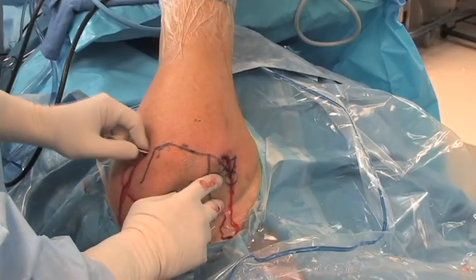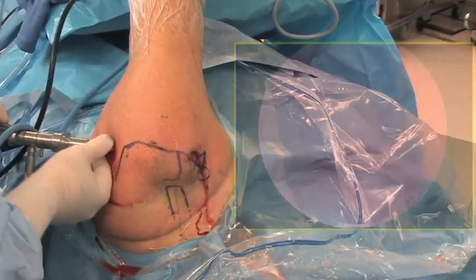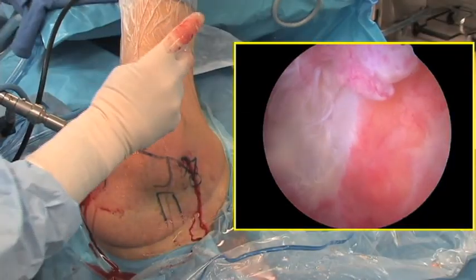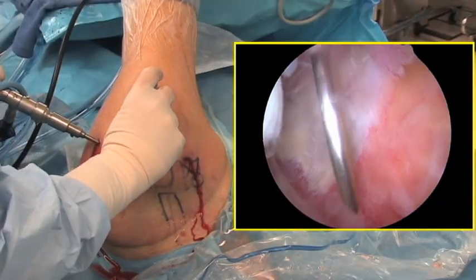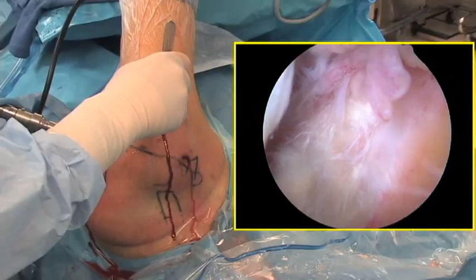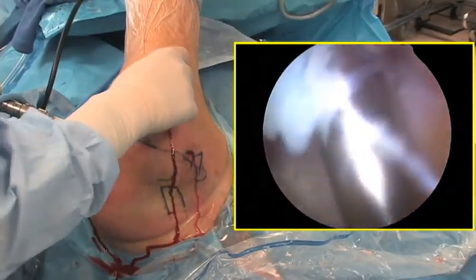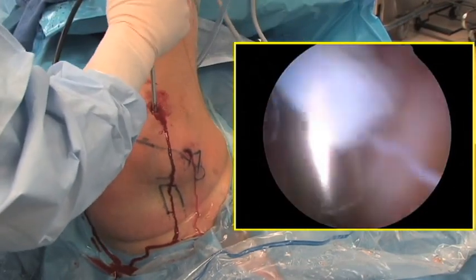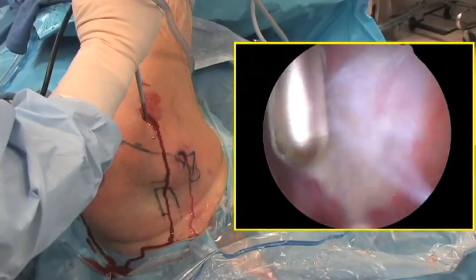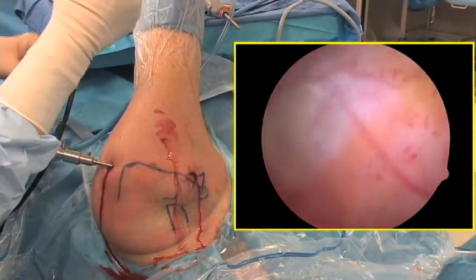The arthroscope is then removed from the glenohumeral joint and placed in the subacromial space. The lateral portal is then established, which is approximately two to three centimeters lateral to the lateral border of the acromion, at the junction between the anterior and middle thirds of the acromion. A spinal needle is used to find the proper trajectory. An 11 blade cuts the skin, a blunt trocar penetrates the deltoid fibers, and an arthroscopic shaver is placed into the subacromial space. The shaver is then used to remove the bursa, starting anteriorly underneath the coracoacromial ligament and moving posteriorly and then laterally under the deltoid.